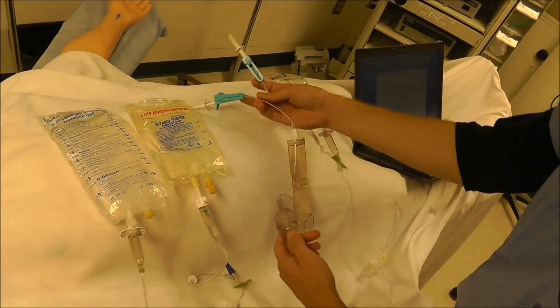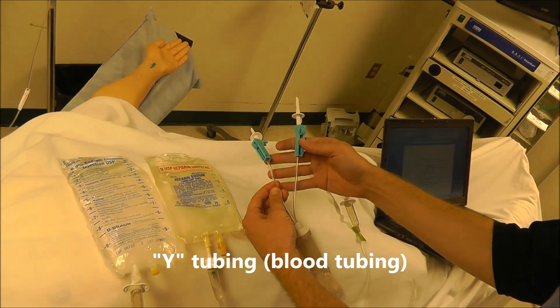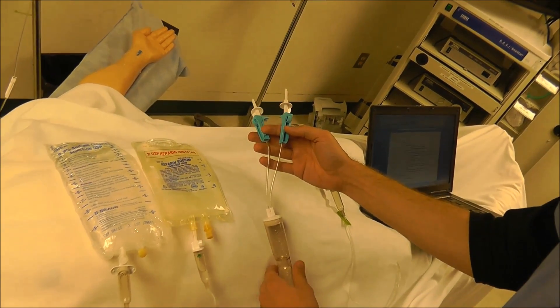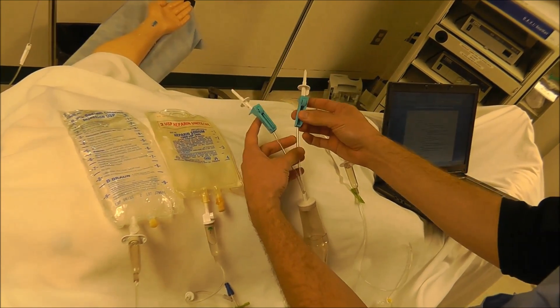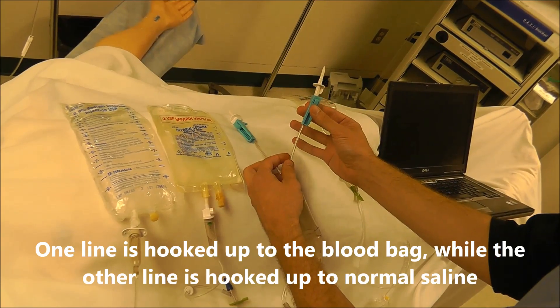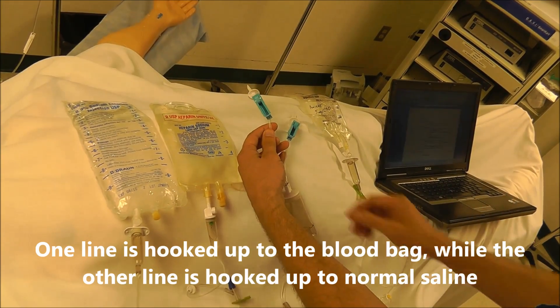The next type of tubing available is called Y tubing or blood tubing. We use this tubing anytime we want to run intraoperative blood products. The Y design allows us to hang blood products on one line and then flush those blood products in with saline on the other line.